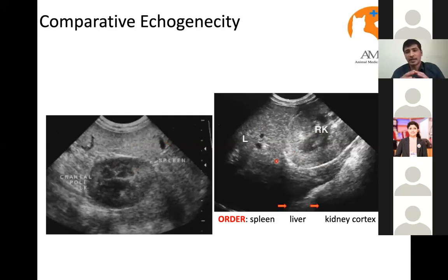Most of the time, before saying there is some pathology, for example if there is hepatitis or liver cirrhosis, the liver looks more whitish compared to the normal. Normally the spleen looks more whitish than the liver. So if the liver looks more white in comparison with the spleen, then we can say there is something wrong. So we always need to do this comparison, as I mentioned earlier.